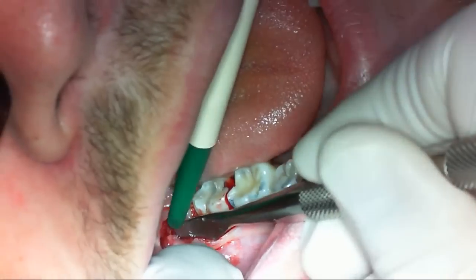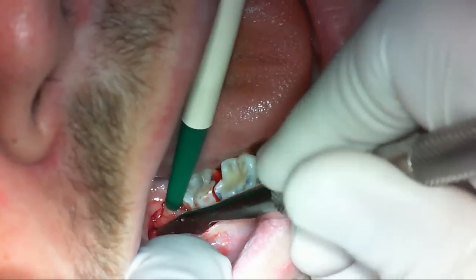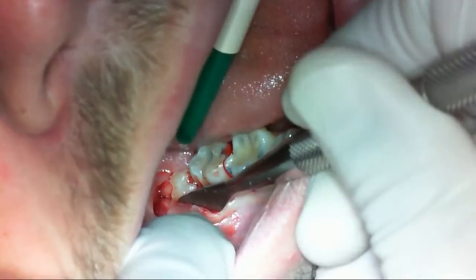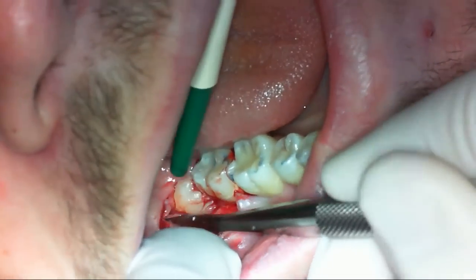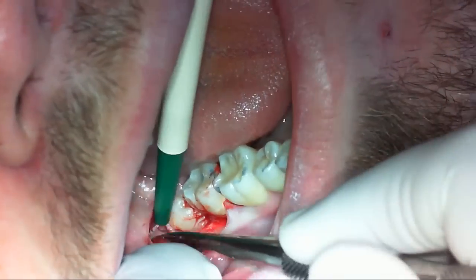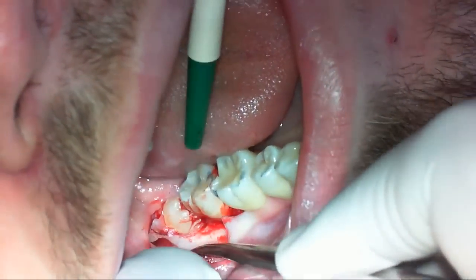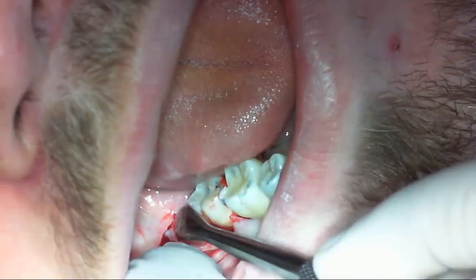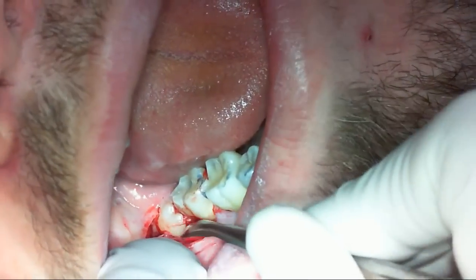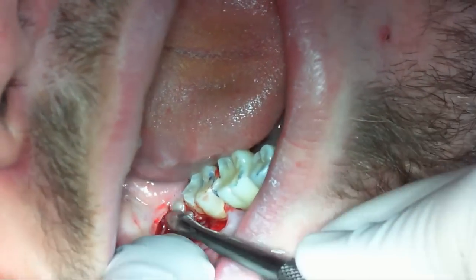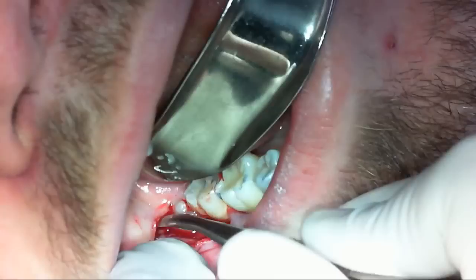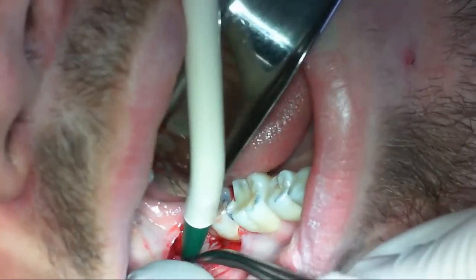A very common mistake is not extending your incision mesially enough — that's where you can tear it mesial or medial to the seven. When reflecting, use firm controlled pressure against the bone and just avoid tearing the soft tissue. I don't want to reflect the distal or lingual part much, to avoid any pressure on the lingual nerve.